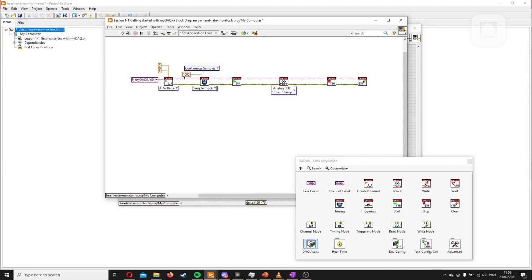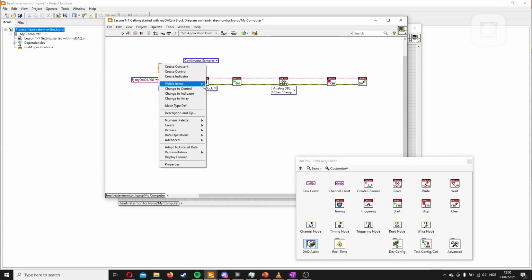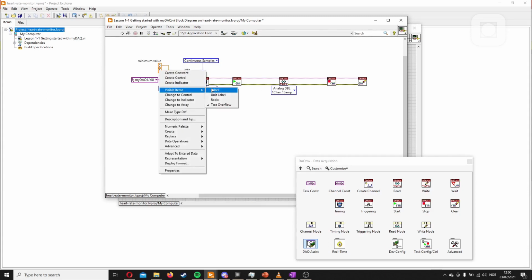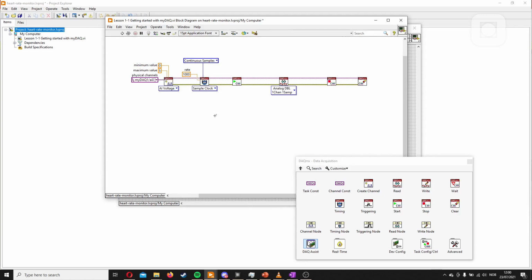All these numbers can be confusing after a while. So a good practice is to always just have visible labels. Now we know that this is the rate. We will know that this is the minimum value and we will know that this is the maximum value. This is very nice when you come back to the project later and instead of just seeing a lot of numbers, you will see what they actually are. We can also take this one, physical channel.